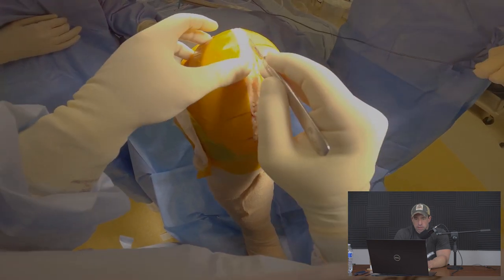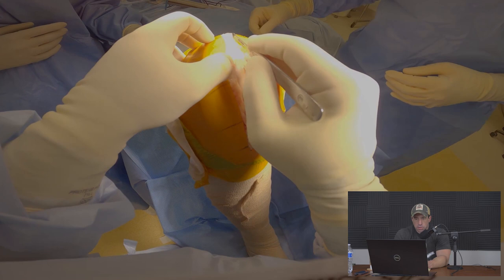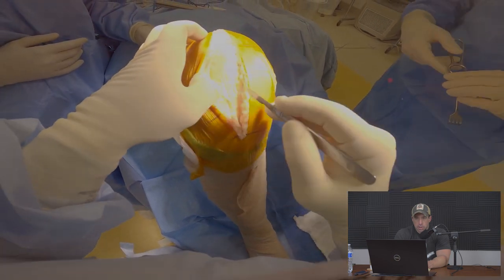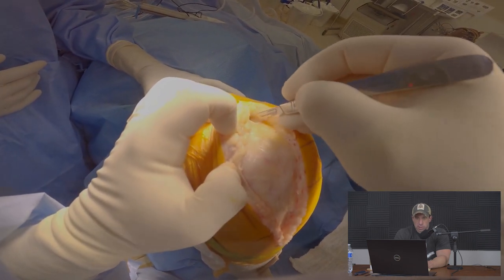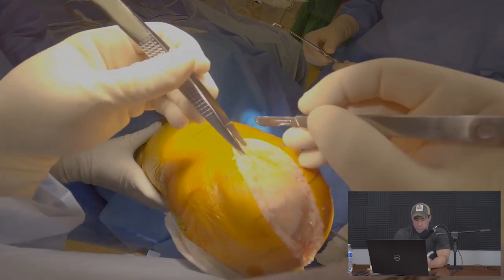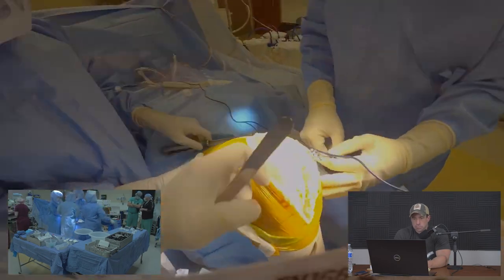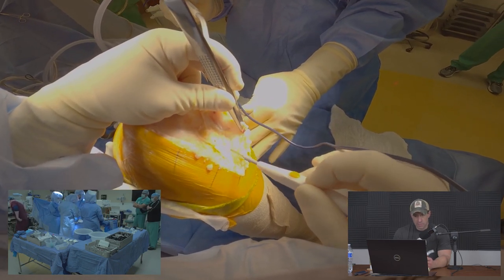Peeling back subcutaneous tissue to begin exposure of the knee. We try not to release any more of this than is necessary — we want good exposure but too much can cause additional bleeding and swelling. Here we're completing some of the release of subcutaneous tissues.